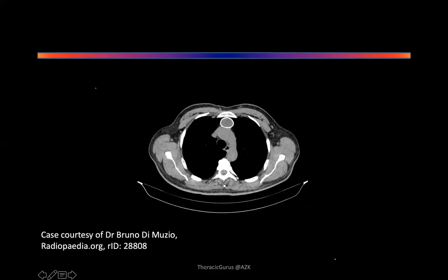Describe this to me. This seems to be a non-contrast CT. In the prevascular area, there is a solid lesion with a peripheral rim of calcification just in front of the arch of aorta. Let me stop you for a second. That calcification is a line which we have put. I'm sorry about that. I put it there. It's in the prevascular area. Let me help you. That is not there. Homogeneously isodense kind of lesion.